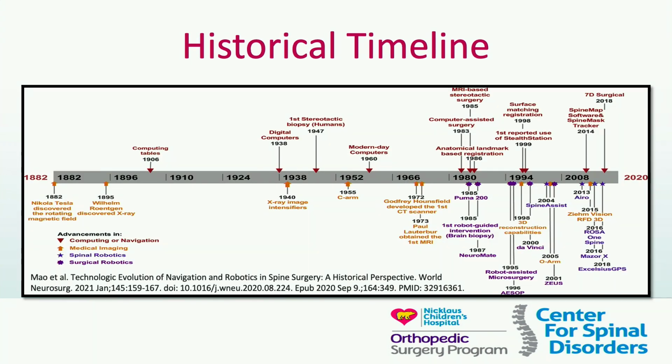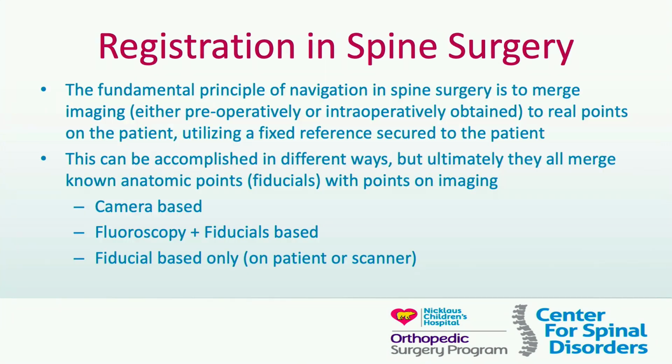One of the things we really see as we go through historically is that more recently there's been a lot more research and publications on this as we've learned a lot more about its utilization. But what we see is that a lot of it has to do with pedicle screws, and we'll get more into that later on, and how that just scratches the surface of what we really need this technology for.